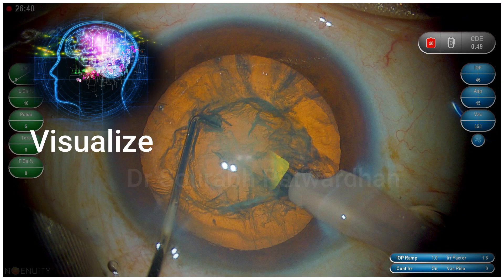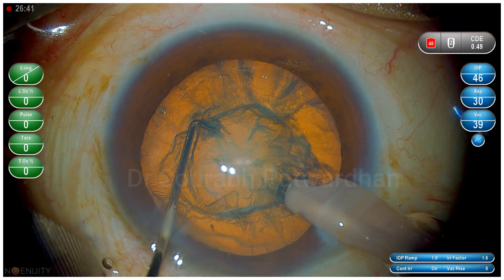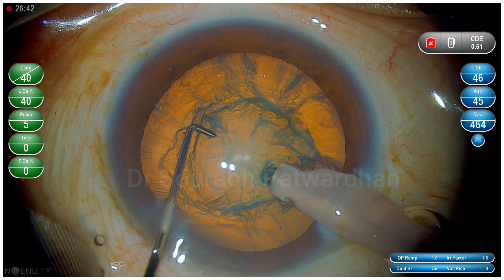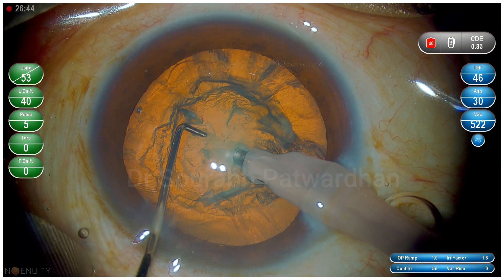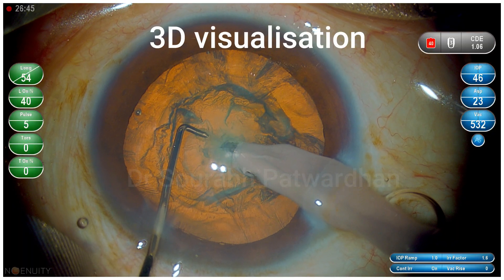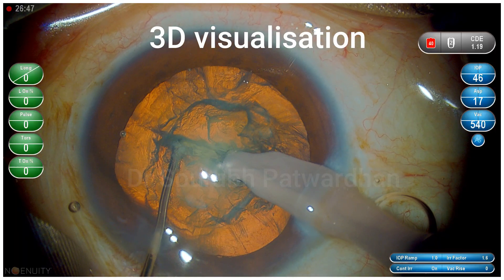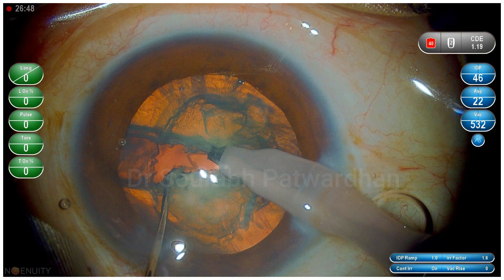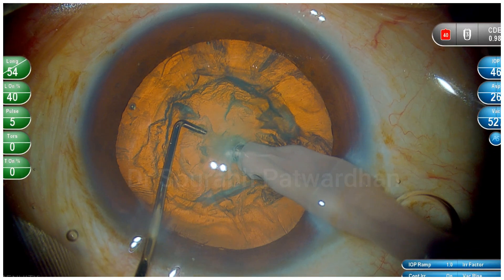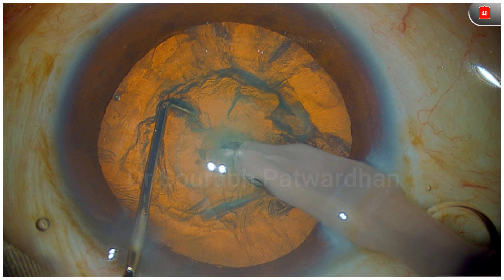I must visualize before I start from where I am going to bury the tip. I am starting from the CCC margin and then going deeper into the central part of the nucleus. Take that little moment before you start, and once you achieve the right depth — which is guided by the 3D visualization when you are operating — you can get a perfect chop in almost each and every case.